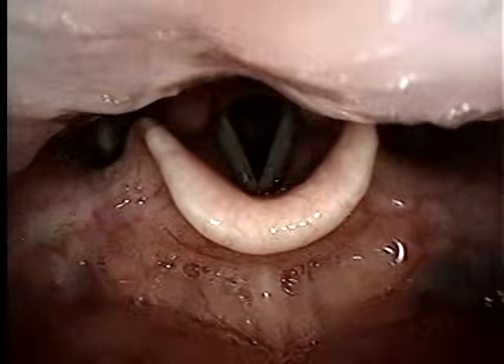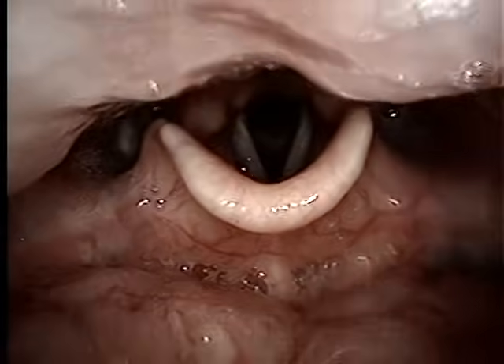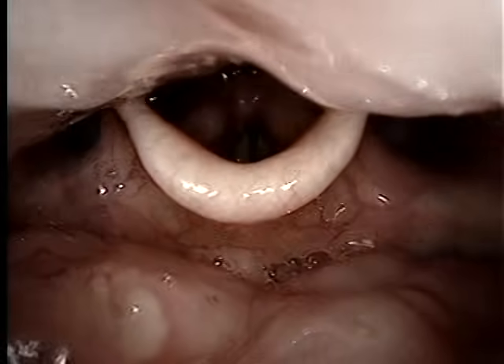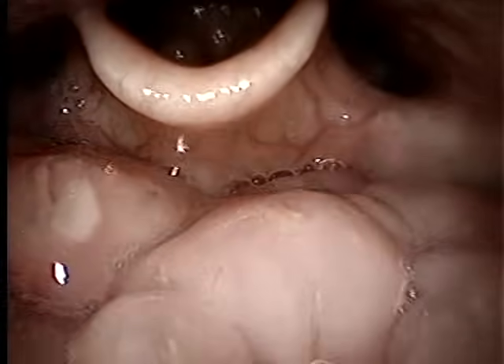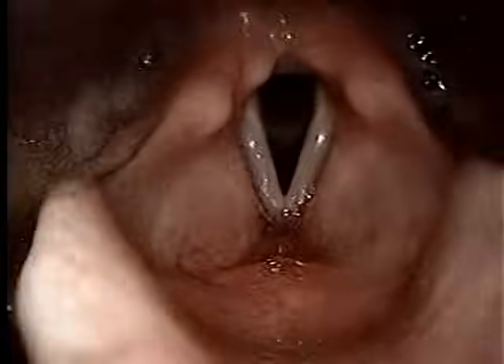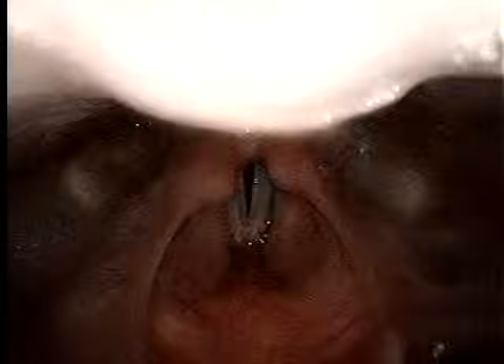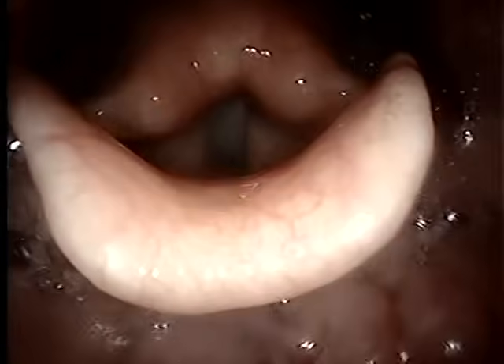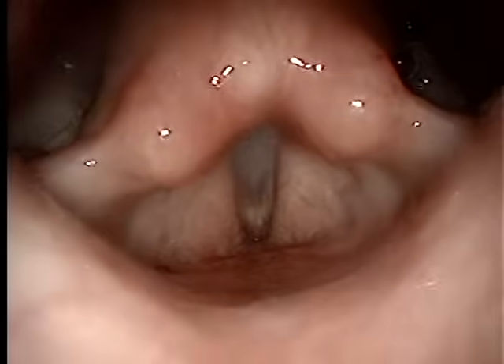I felt like I was doing this — I think it was just a lot of vibration. It's harder for it to connect when you're pressing, when you're using some extra pressing there. So I think that's what it is. Try it again though, if you feel like you were moving up. Hey, Mr. Arnstein, here I am. Oh, that was easier. Yeah, that was better.